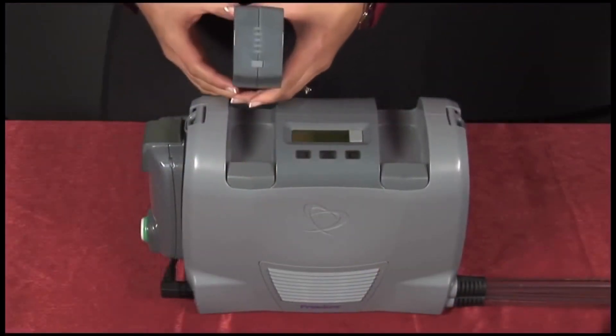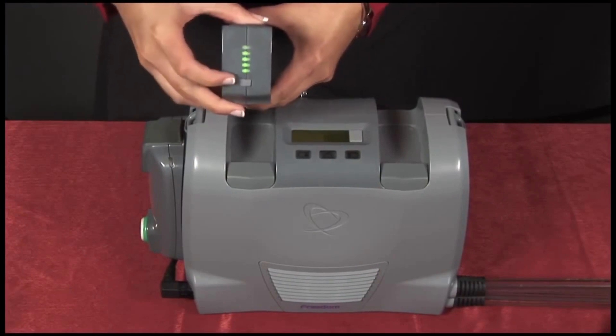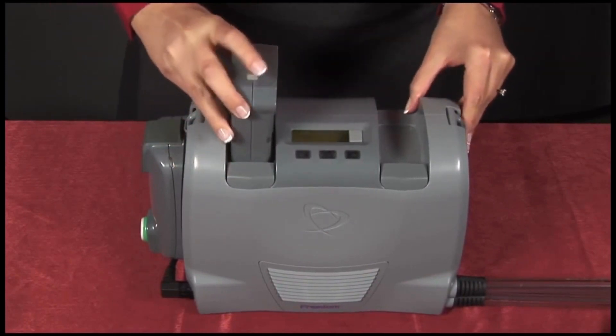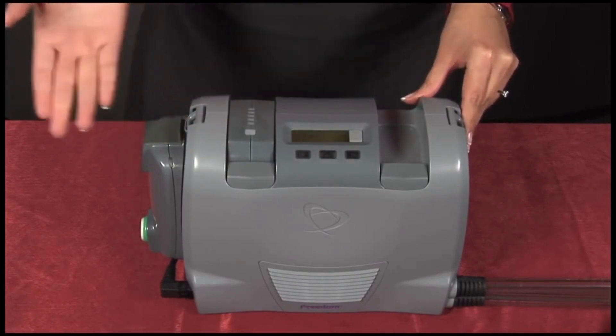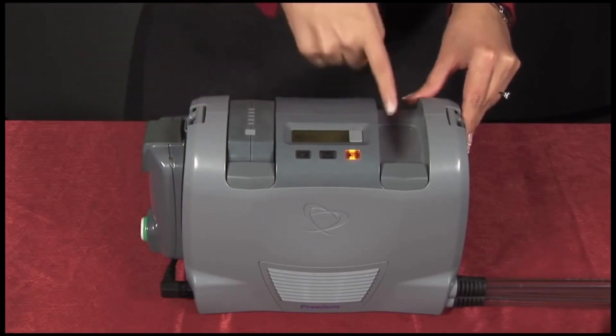Before inserting a battery, you'll want to check the battery fuel gauge. Press the button on the top of the battery. This battery indicates that it's 100% charged. You can insert the battery by pushing it into the battery well. And the driver is started. You'll notice that I'll get an alarm shortly after, telling me that I'm missing a battery in this well.